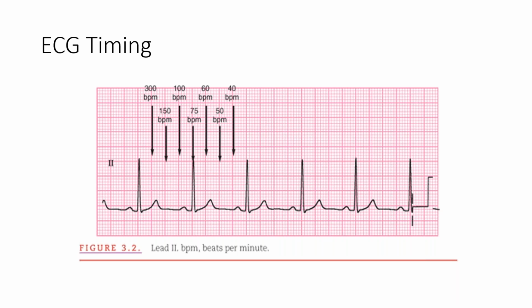The graph paper, if you look at it, you see bold squares and you see small squares. The little squares are 1 millimeter each. The bigger squares are 5 millimeters each. So if we had a heart rate starting at that R wave on the left-hand side, it's right on that bold line on the graph paper. If we go to the next bold line and have another heartbeat there, it would be 300 beats per minute. And as we count out, same thing.